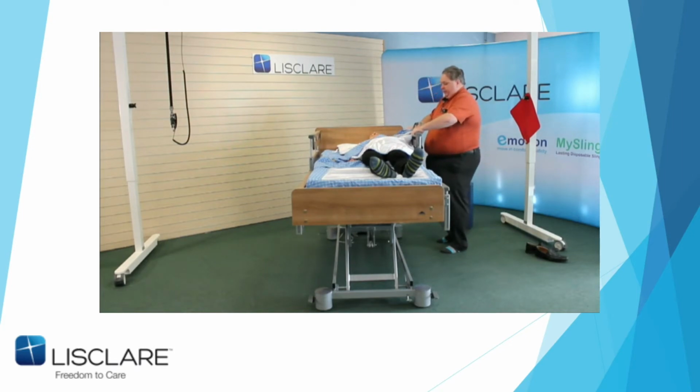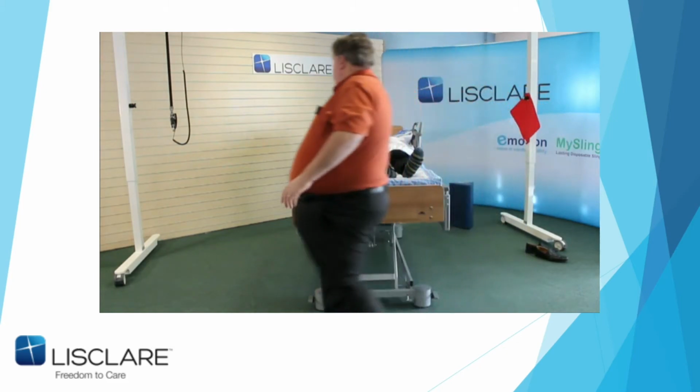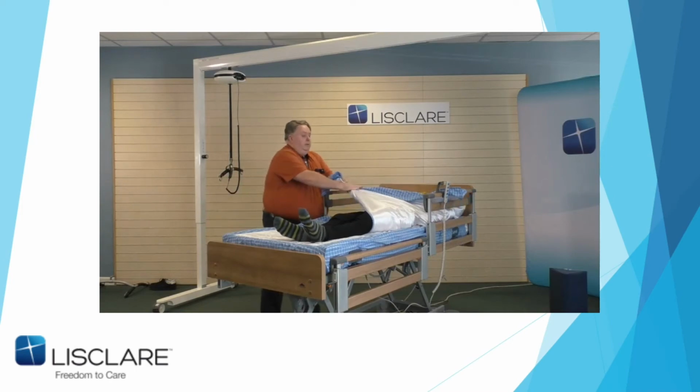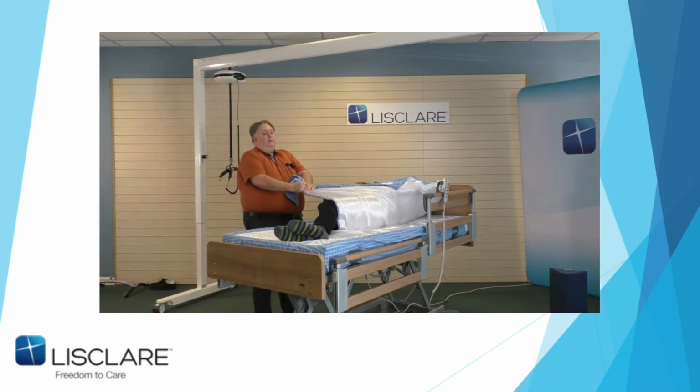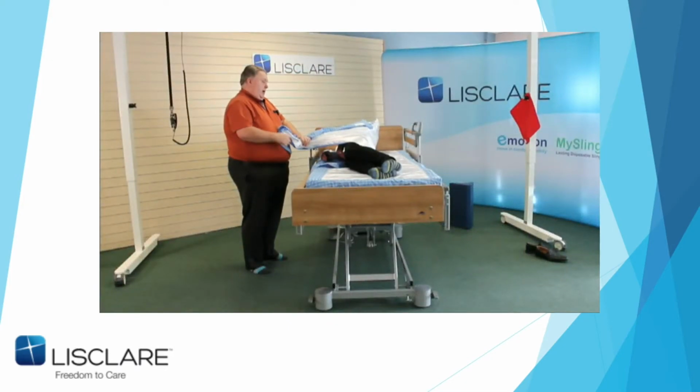Lift that side wheel, believe it or not. And I can lift this one. I'll walk around here. And at this point, I can very simply turn John. Now again, that's not my size and weight doing it. Again, I probably should have brought my wedge with me to put it in over the top.